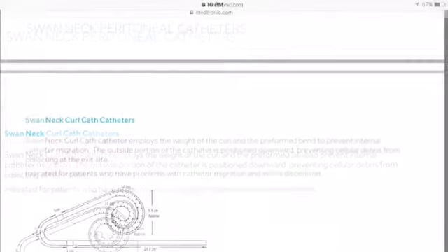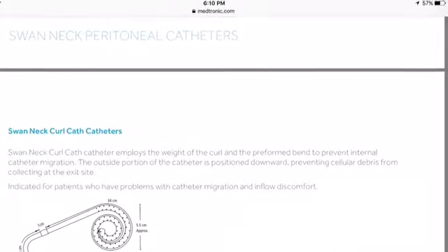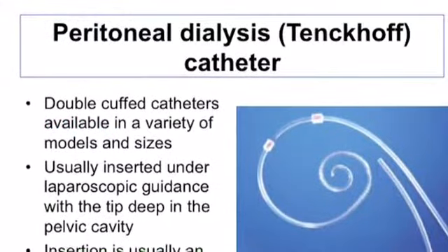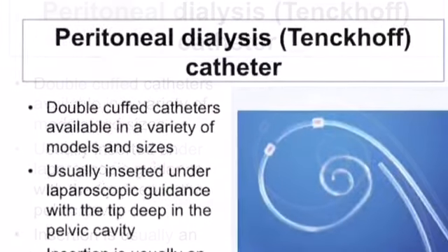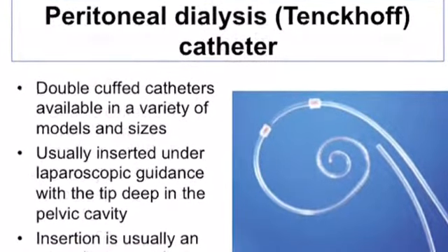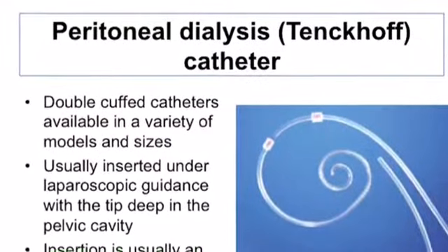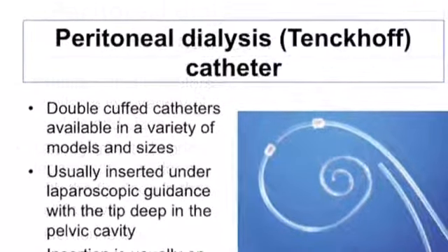There is lesser dialysis solution leakage, and because of the curved tunnel, the catheters are specific for the right or the left side. Another advantage: the incidence of exit site infections may be reduced. Disadvantages: it can only be inserted surgically and is less commonly available, so it can only be inserted by specialized personnel.